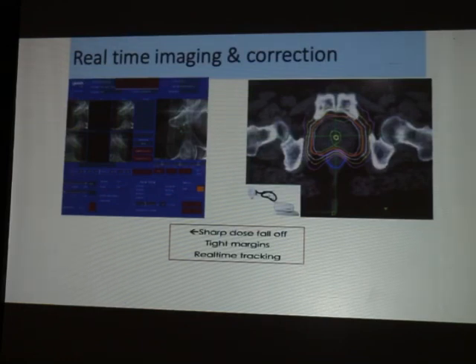With radiosurgery, either with CyberKnife or other technologies, these 6 weeks can be shortened to 5 days. On the extreme right, you can see the prostate with the radiation, and innermost there is a yellow circle, which is the urethra. You can see how beautifully you can spare the urethra. That means you are giving a very high dose to the prostate while sparing the urethra. Destruction of the prostate parenchyma doesn't matter; it is only when you destroy the urethra that there is a problem. So this new technology can deliver a very high dose to the prostate and at the same time spare the urethra.